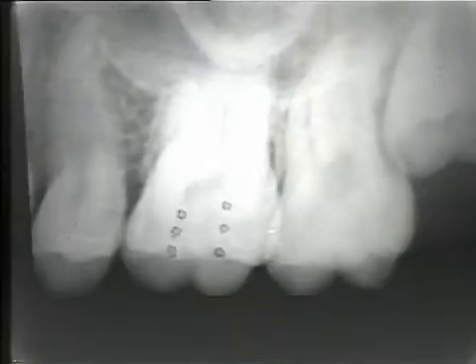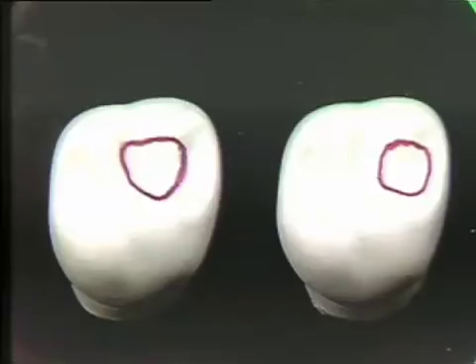Study this radiograph of the maxillary molar. Note the shape and mesiodistal size of the pulp and where it transfers to the surface of the tooth. In this case, the pulp is slightly mesial of the center. Now study the crown shape of these models and try and decide which should be the outline form of the pulp. You should have said the one on the left. The area bounded by the mesiolingual, mesial buccal, and distal buccal cusp forms a triangular area with the pulp very much in the center of that area.